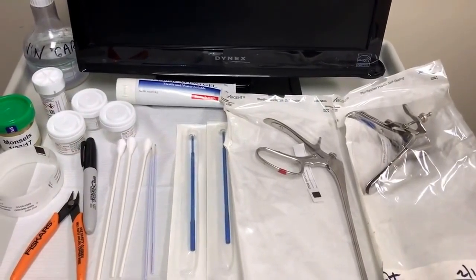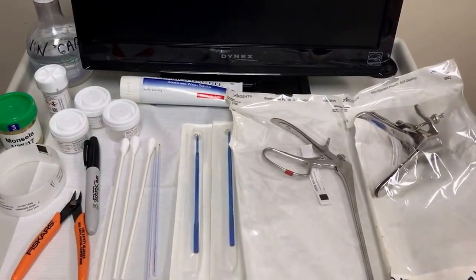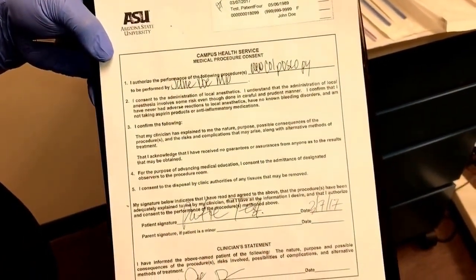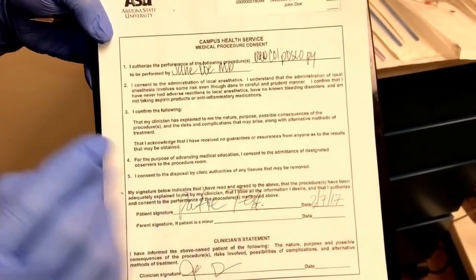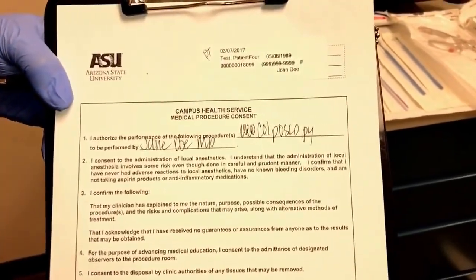Today we will be filming a demonstration of a colposcopy, and the instruments in front of you are the ones we will be using today. Most importantly, before any procedure is started, you want to make sure that you have the medical procedure consent form filled out by the provider, signed by the patient, and also has the correct information on the patient label.